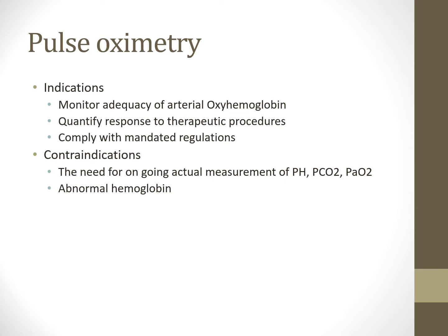We also use it to quantify response to therapeutic procedures. So, hey, did I increase your heated high flow nasal cannula from 30 liters a minute to 40 liters a minute? And now I see an increase in pulse oximetry, right? That's a sign that I had a therapeutic response, right? Comply with mandated regulations, especially if they're post-procedure or they're on pain medicines, things like that. They might require those patients be on monitoring to include pulse oximetry.